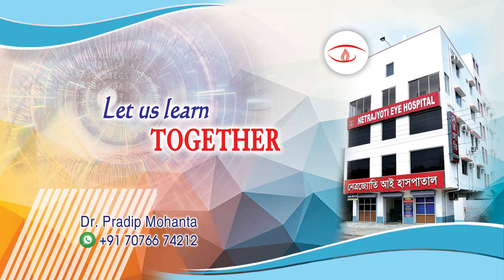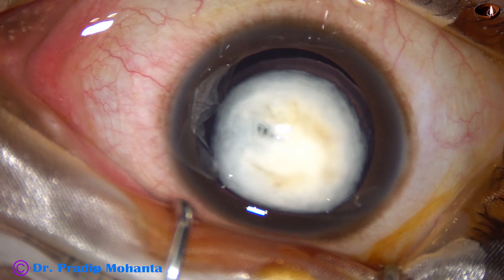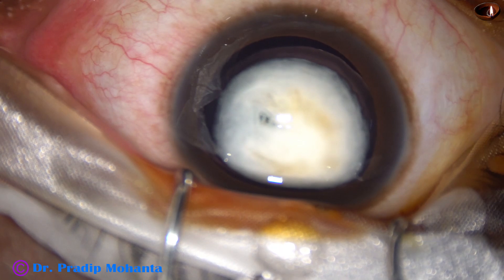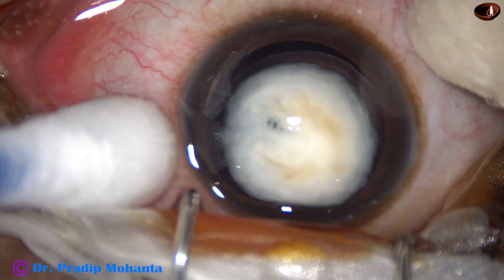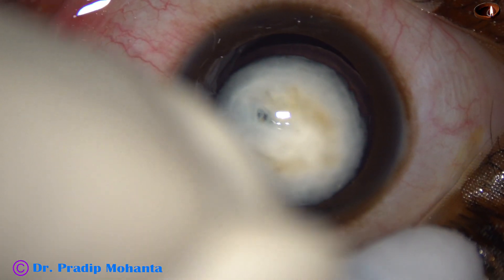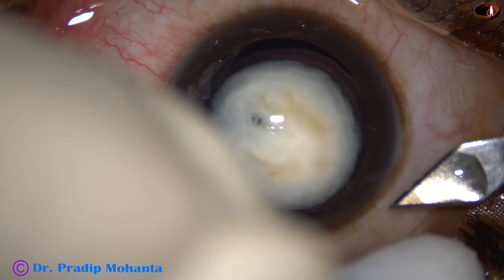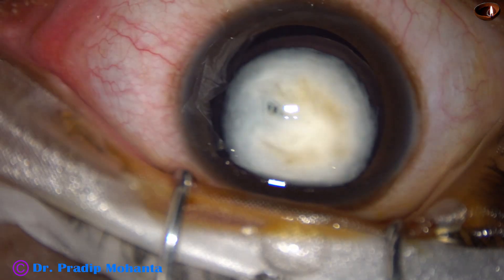Friends, welcome to my workplace at Ranagh Heart, West Bengal, India. This is a 22-year-old young man with a dense cataract. His other eye was operated elsewhere, but he didn't get any vision in that eye, and he took shelter in our Blind Boys Rehabilitation Center. I examined this eye, found this dense cataract, and convinced him to get operated.